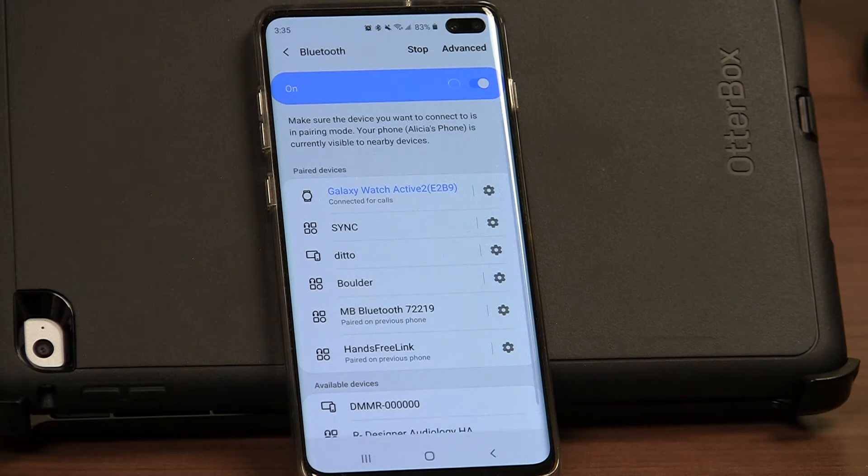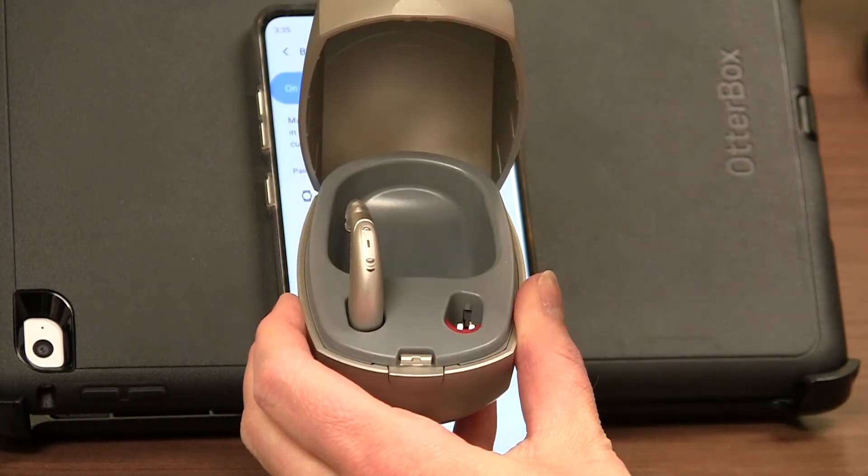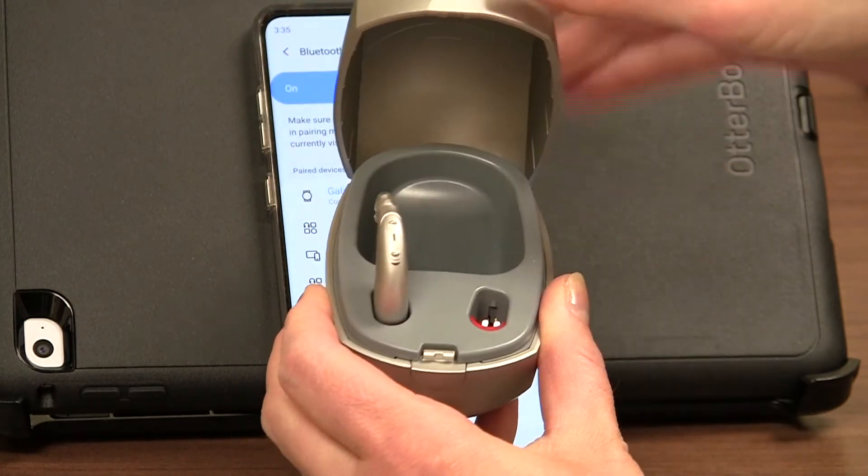At this point you need to turn the hearing aid off and back on again in order for it to be found. If you have rechargeable batteries, you can simply put the hearing aid in the charger and take it back out, and that will turn the device off and back on again.